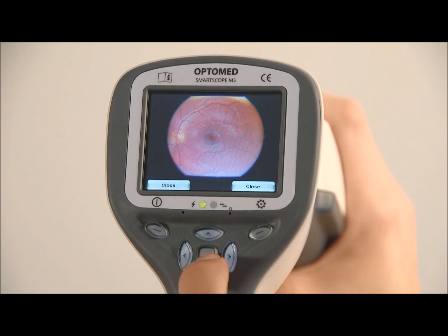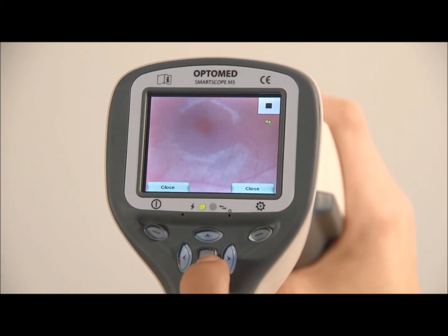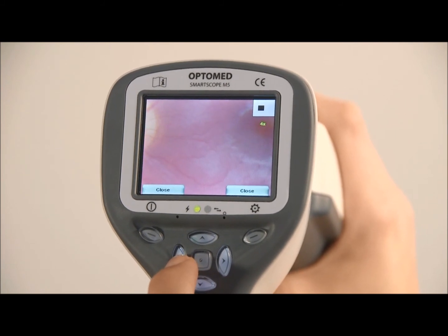The taken image is displayed on the screen until the user clears the image by pressing the shutter left or right soft key. The image can be zoomed in the instant preview by pressing the middle key. There are four zoom levels, and pressing the middle key activates the next level. Move around the image by using the arrow keys.